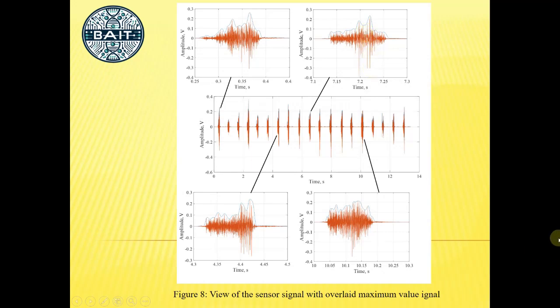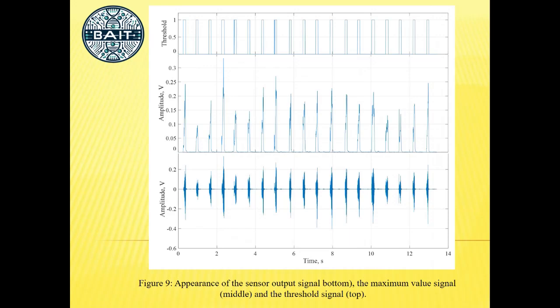As noted earlier, it is proposed to use low-frequency piezoelectric transducers as actuators, which will create mechanical vibrations under the action of electrical control signals. Thus, for this purpose, it is proposed to form an amplitude-modulated signal, the carrier frequency of which will correspond to the resonant frequency of the transducer, and the envelope component will contain information about the effects on tactile sensors. That is, it will be the maximum value signal, the obtaining of which was described above. The resulting amplitude-modulated signal, after amplification, is fed to the corresponding actuator.